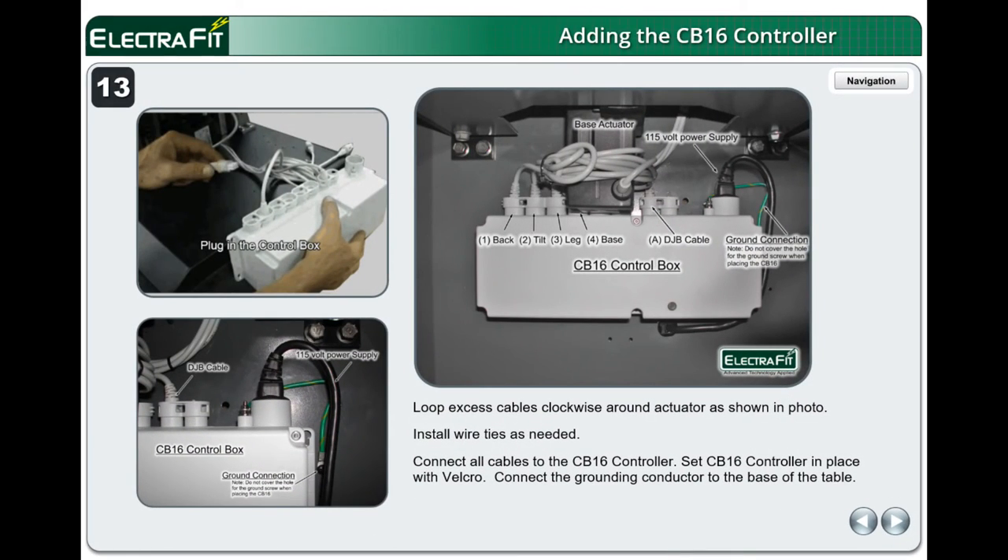Loop excess cables clockwise around the actuator as shown in the photo. Install wire ties as needed. Connect all cables to the CB-16 controller and set the CB-16 controller in place with Velcro. Connect the grounding conductor to the base of the table. Note: all plugs must be fully seated for the table to function.